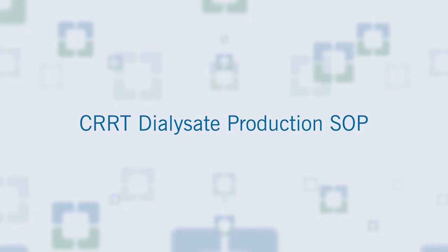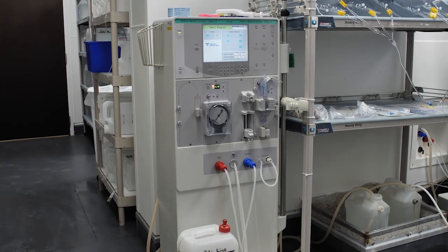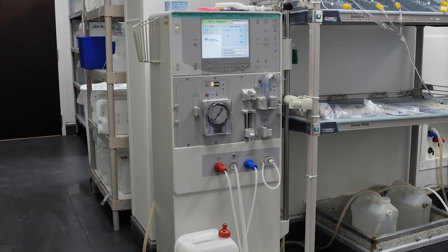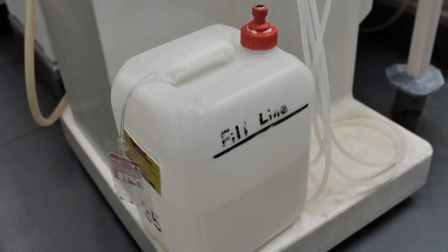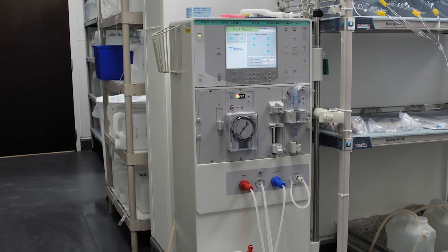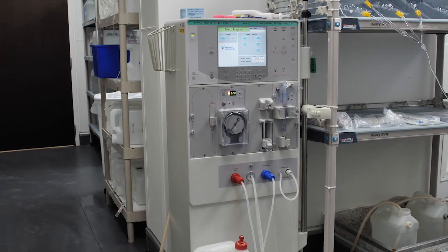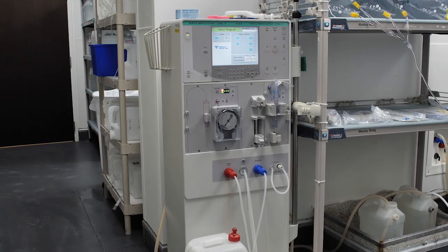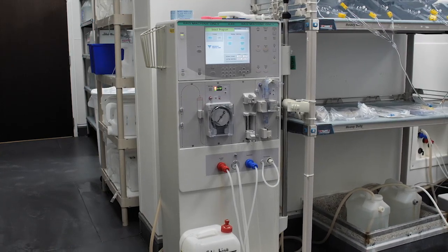This is the CRRT Ultra-Pure Dialysate Production SOP. The solution is prepared using a volumetric single-pass dialysis machine; Fresenius 2008-T and K2 are used here. These single-patient proportioning dialysis machines use two concentrates — acid and bicarbonate — and mix reverse osmosis product water with the concentrates to create dialysate. This solution is a replication of the standard dialysate used during intermittent bicarbonate hemodialysis with the correct ionic composition and physiological temperature.